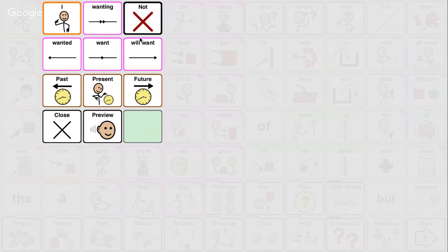Now, this is how a verb inflection looked in the English system. I have the pronoun I pre-selected, and I get the conjugations that make sense for this pronoun. Because again, in English, once you have a pronoun in the sentence that is followed immediately by a verb, 99% of the times that verb is conjugated to agree with the grammatical person of the pronoun.